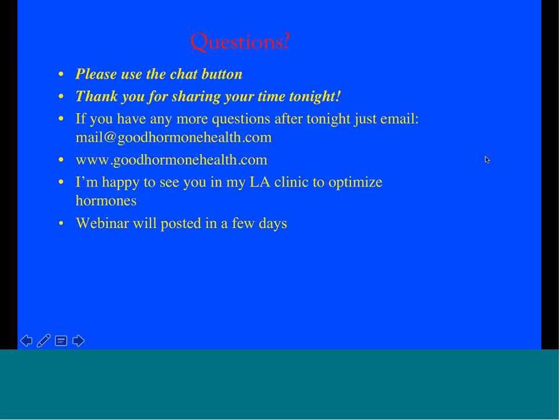Linda asked, thank you for your webinar. Can this device be used for people having low cortisol issues to better regulate? Yes, exactly. I feel at times under stress, I'm having lows. This can be tested and can be used to adjust accordingly. How accurate is it? The medical director said that he did correlate this with commercial laboratories, and it was very highly correlated. He did feel there's a little bit of dependence on how you collect the cortisol, but I think our patients are smart, and I don't think there's any problem with that.